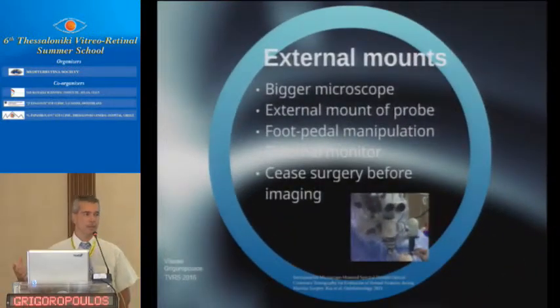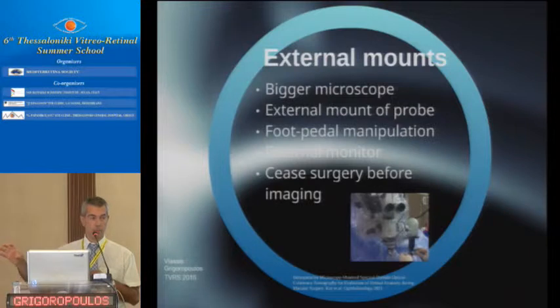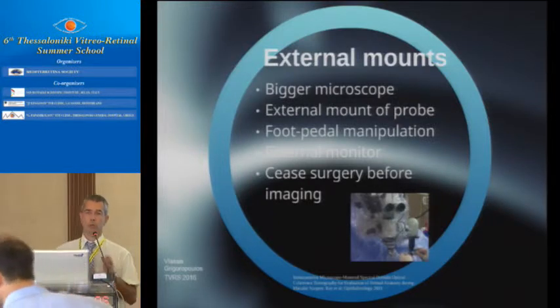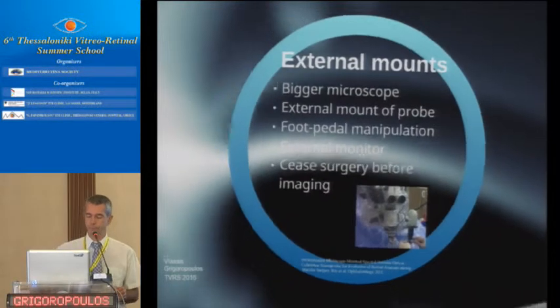So the next thing that they did was to externally mount the OCT on the microscope. So you got a bigger microscope with an externally mounted OCT machine. It was controlled by the foot pedal. You could see it on a monitor, but what the surgeon had to do was stop the procedure, move the microscope away, put the OCT in, do the scan, and then put the microscope back and carry on the procedure. That also would be very disruptive to the surgical flow.